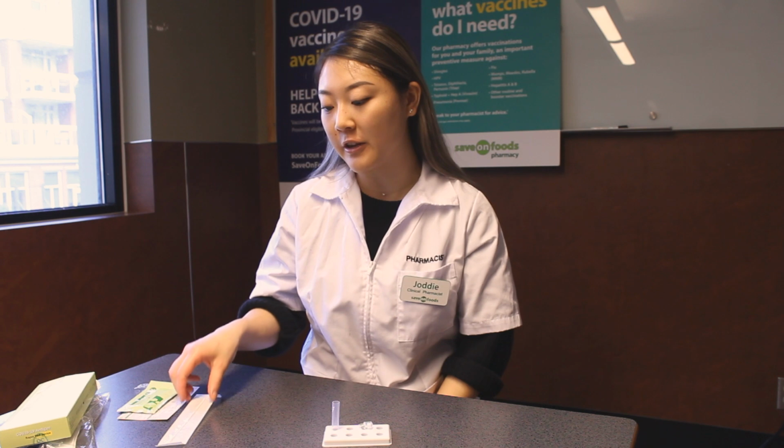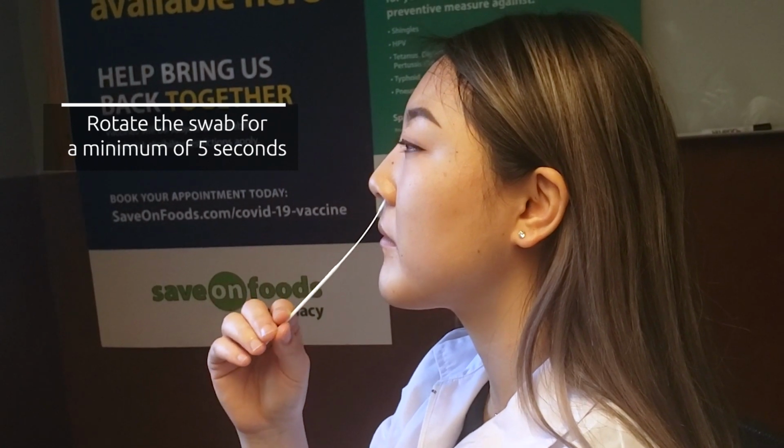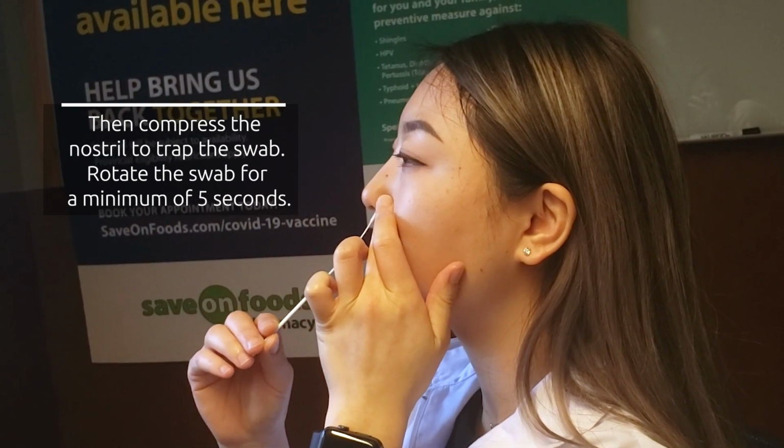Now we're going to do the nasal swab. To do the nasal swab, we're going to open up the packaging here, and we're going to rotate in each nostril for 5 seconds. And after that, we're going to trap the nasal swab by pressing the nostril for another 5 seconds.